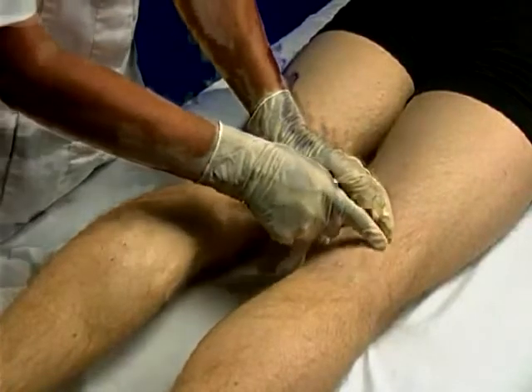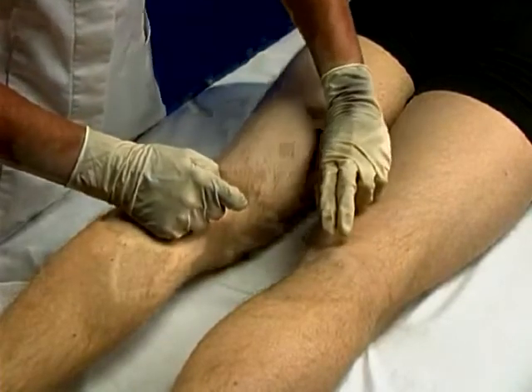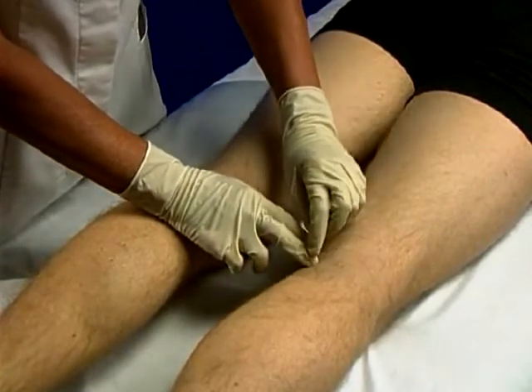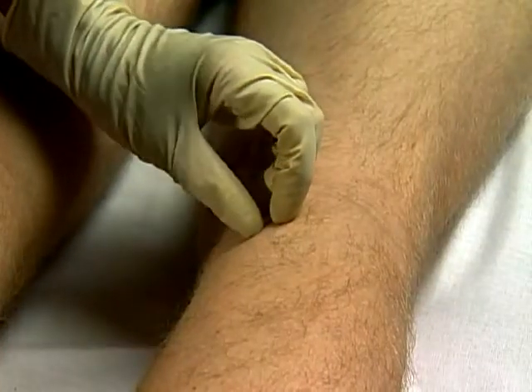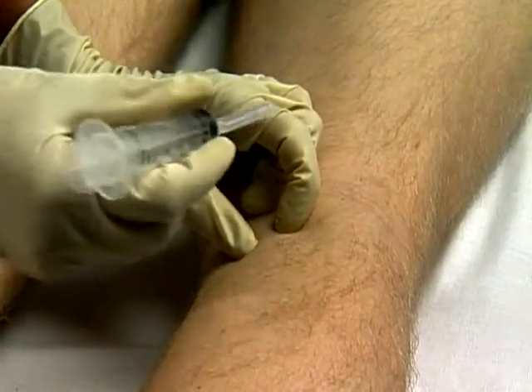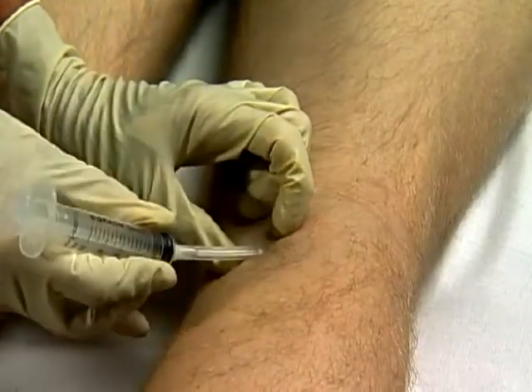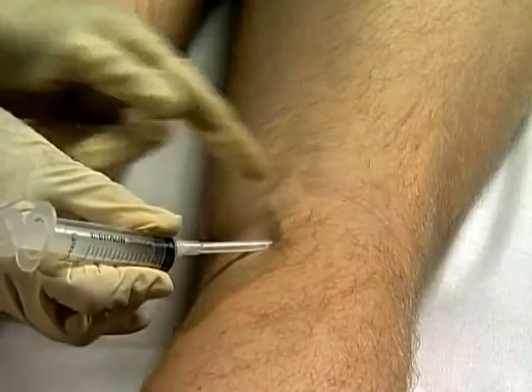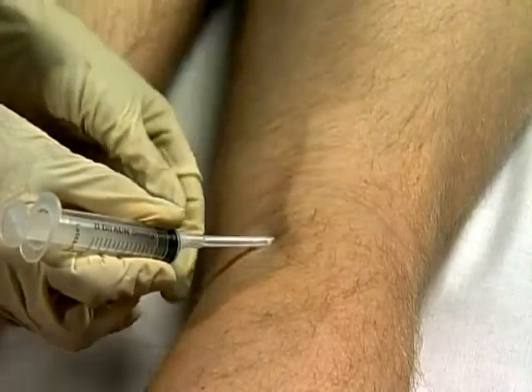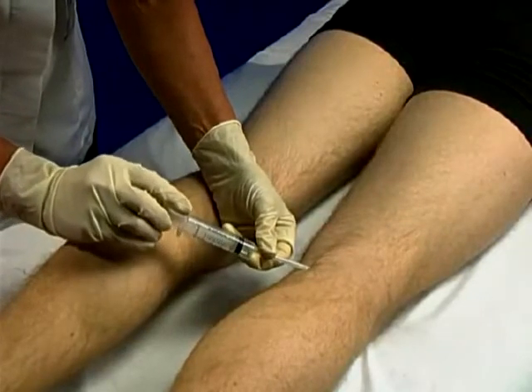The Baker's cyst lies in the popliteal fossa at the back of the knee. Identify midpoint of the fossa, move 2 fingers medially and 2 fingers distally. Mark entry point here, clean and firmly stretch the skin, and rapidly insert a large bore needle with a large syringe perpendicularly. Angle up and laterally so the needle slides anterior to the popliteal vessels. Slowly aspirate and dispose of fluid into containers for culture and disposal.